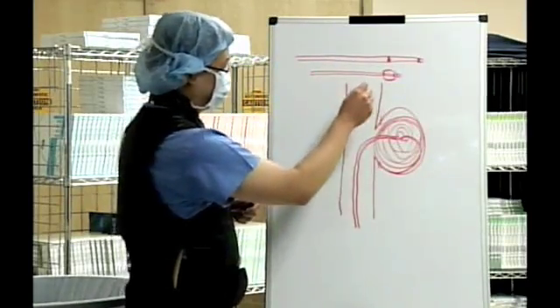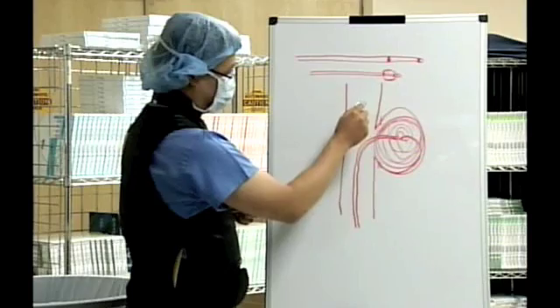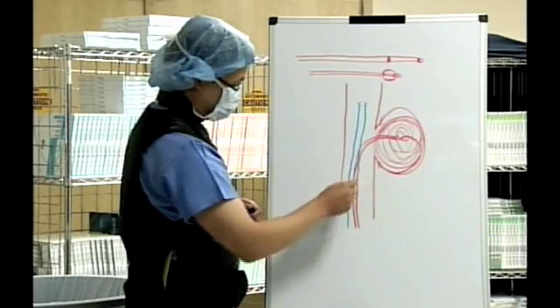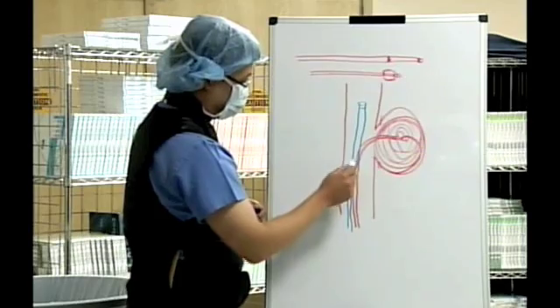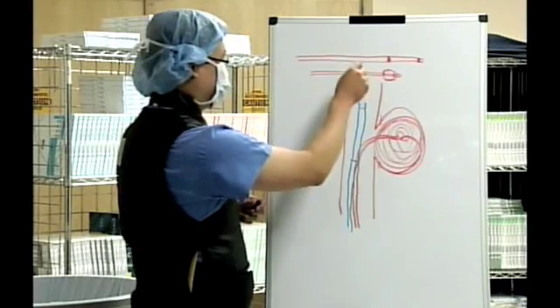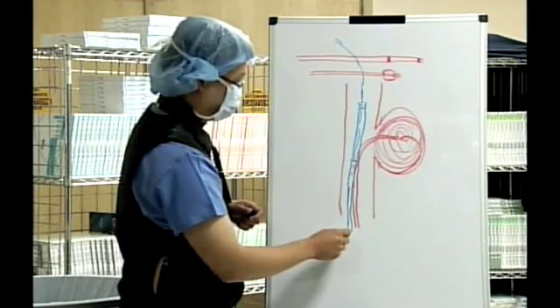Okay. So a balloon catheter is another little catheter, kind of like this. And it'll have marks here and here. There'll be a wire going through here. You'll probably see the wire. There'll be wires going through these catheters like this. So you'll see something like this.